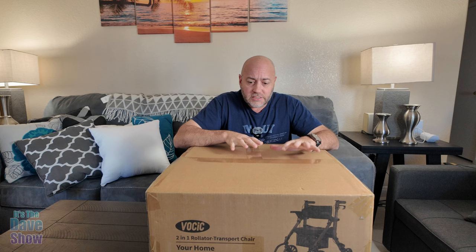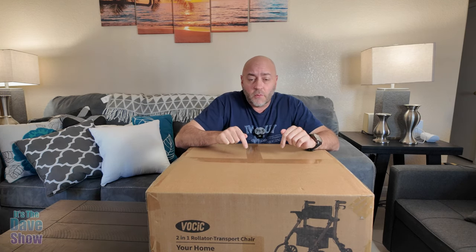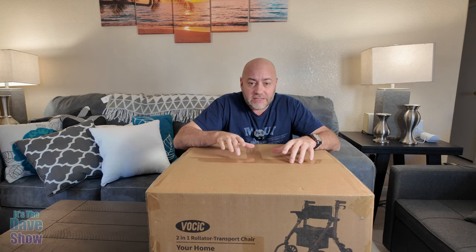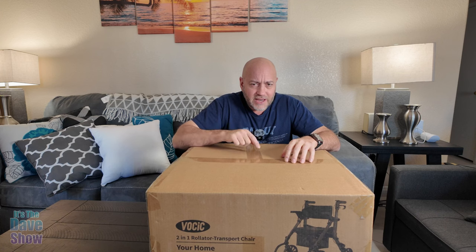That's the brand name and they did send me this product for review. They wanted me to show you what it is and how it works. It comes in a nice little package box, so there's definitely going to be some assembly required. I'm going to open this up, put this thing together, and show you what it is and how it works.